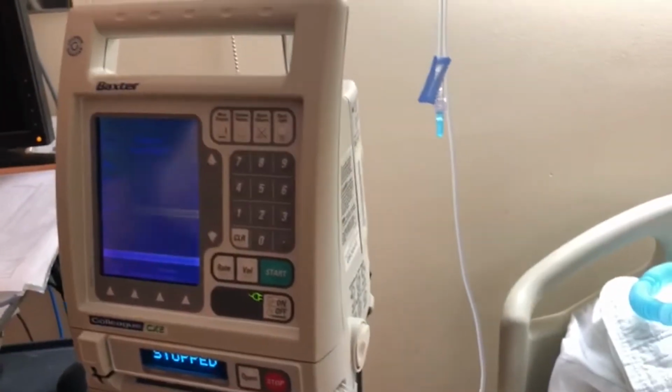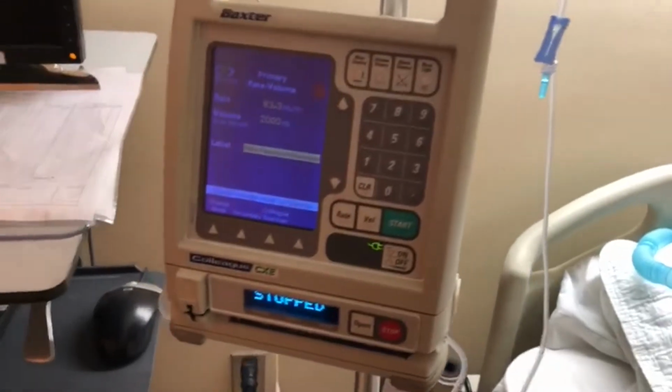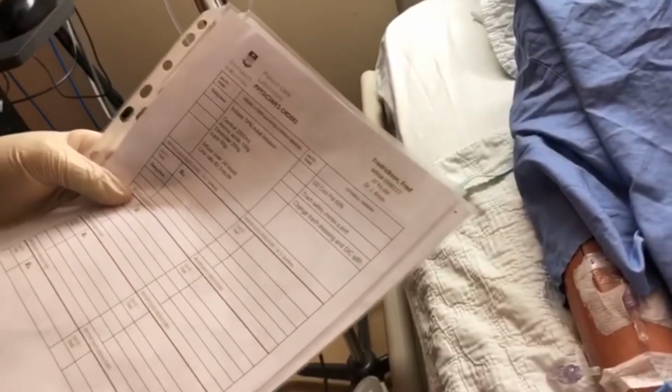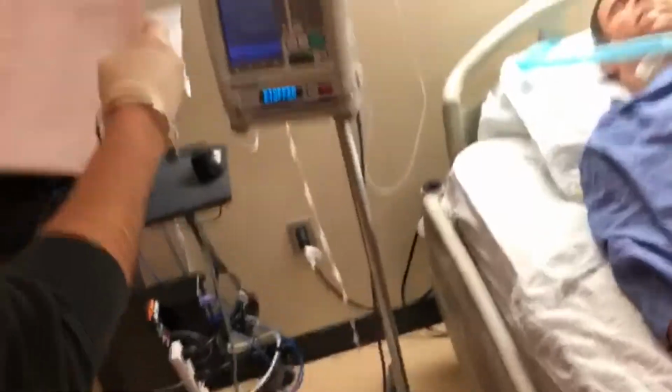What we want to do now before we do this is do our second check. So I can get the requisition and the MAR, and again, we can verify that we have the correct patient by doing the ID band. So Fred Fredrickson, MRN is correct as well, 099127. Good.